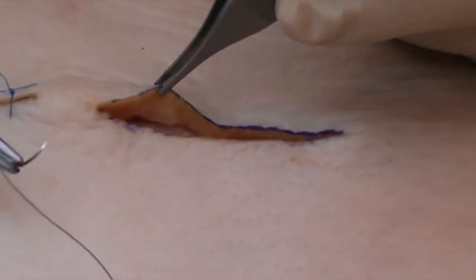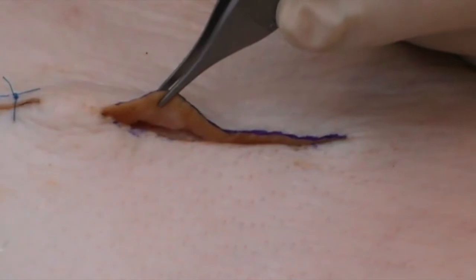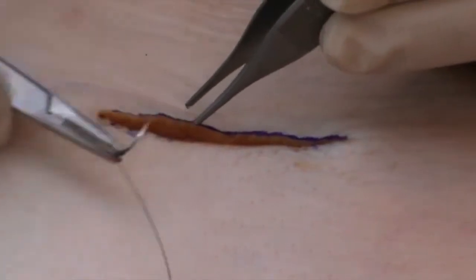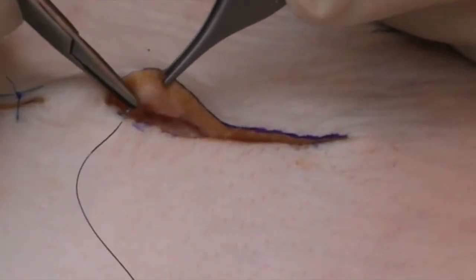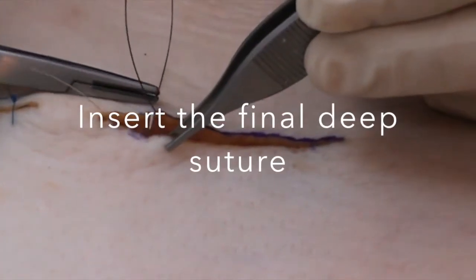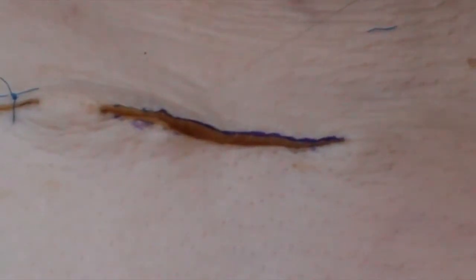An alternative to using a non-absorbable suture for your continuous subcuticular closure — and this is a technique I often use on the back — is to close your wound completely with deep absorbable sutures. In this case it would be the monocryl that I was demonstrating earlier, which I've dyed along the first section purely to make it easier to see what we're doing. And remember, this is deep to superficial, superficial to deep. And then this suture — this is my final one.